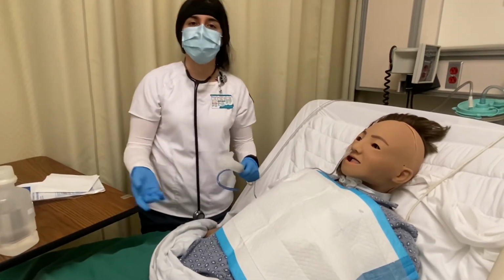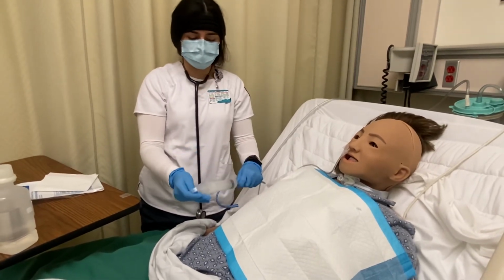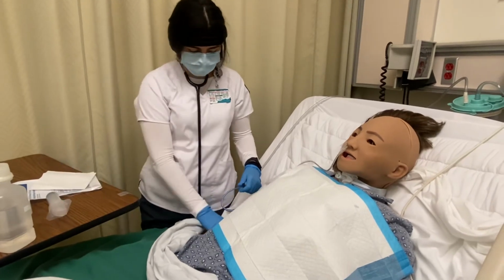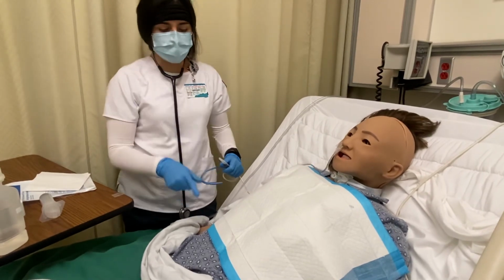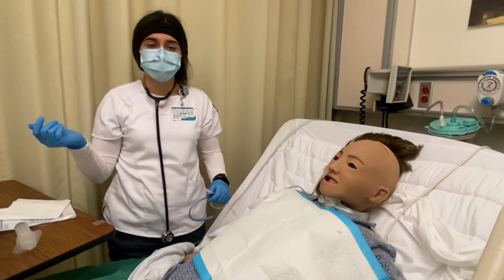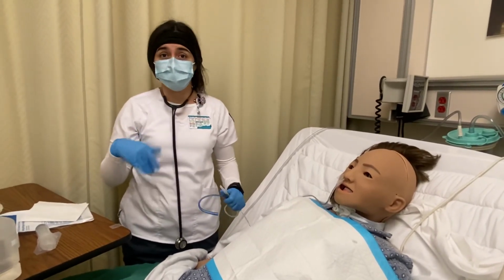And then I would aspirate after. So I grab the juices and see if it comes out. Cool. And then I would go ahead and go for a chest X-ray after, to just make sure that it's in the right place.